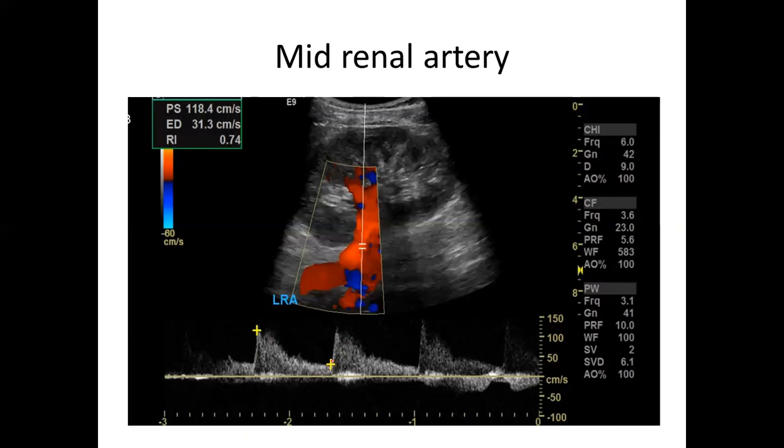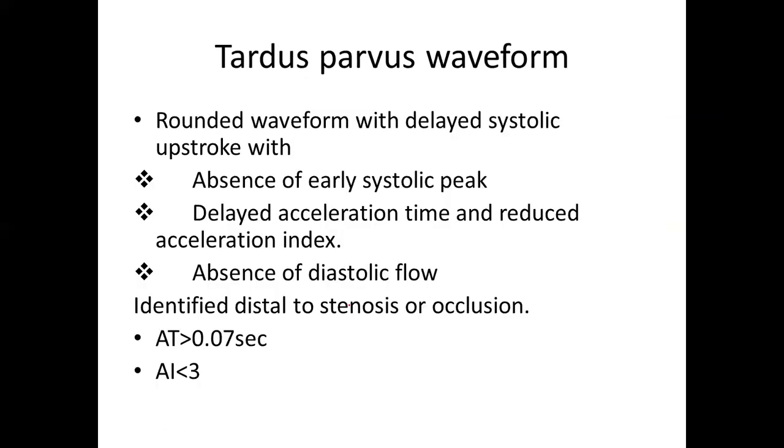Right, so it will also have a systematic progression of this waveform, whereby this slope continues to fall, and our upper part of the waveform becomes rounded in form, as progression of stenosis in the renal artery progresses.